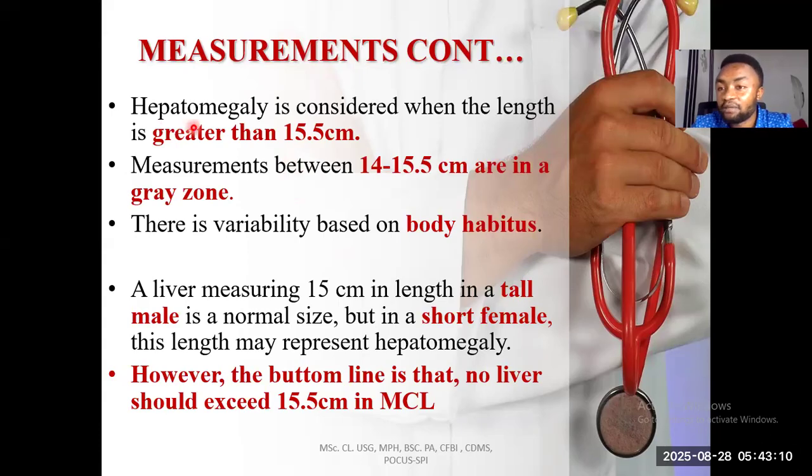Hepatomegaly is enlargement of the liver. Hepatomegaly is something common that you see all the time. Hepatomegaly is not a disease, please. It's not a disease, it's a sign. It's a sonographic sign that there is a liver problem or there is a problem going on in the body.